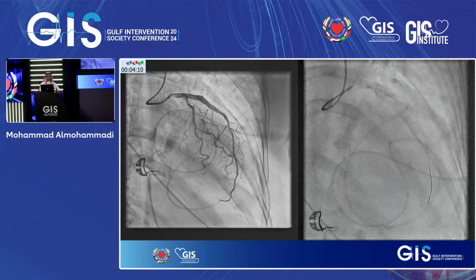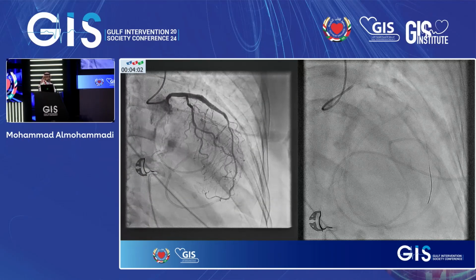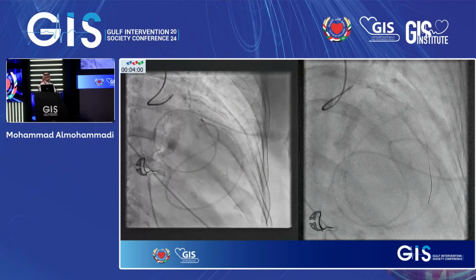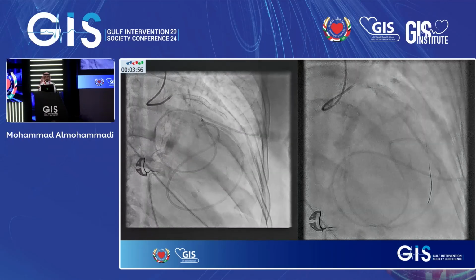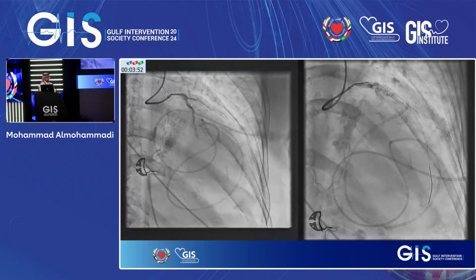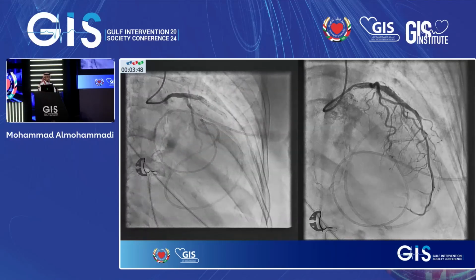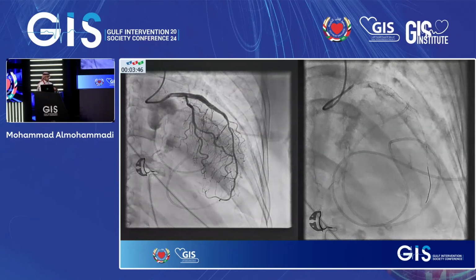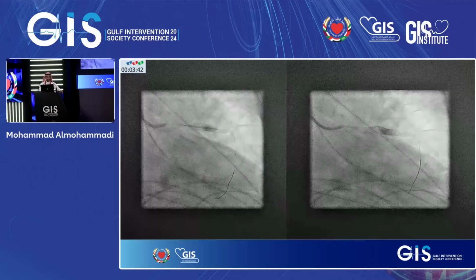But during the night, the patient kept leaking in the pericardial drain, so he had to bring the patient back to the cath lab to see. And we can see here that the leak is still there, though it wasn't there at the end of the procedure. Most likely, this could be due to either the vessel getting expanded after the shock state, or the calcium protruding and creating some space between the stent and the rest of the vessel, which kept leaking.